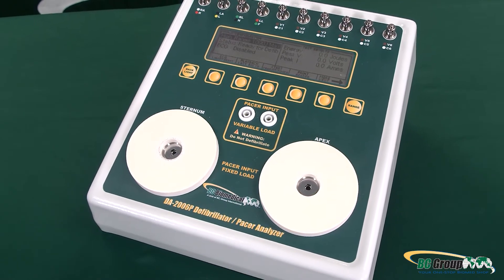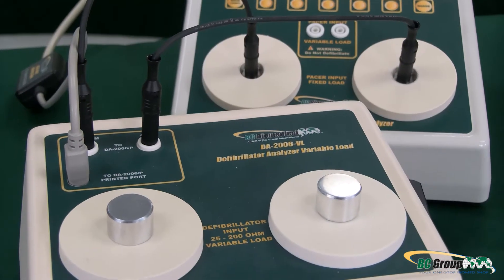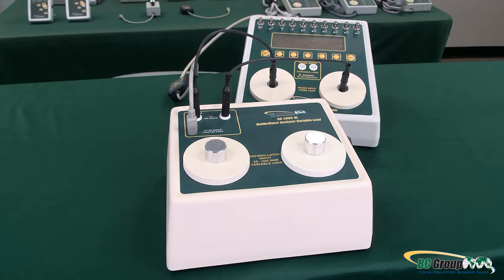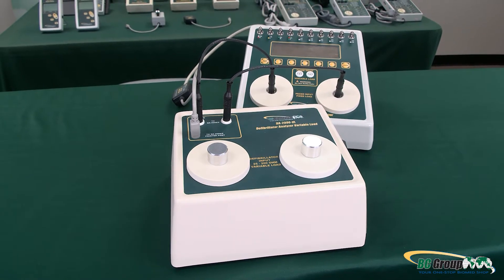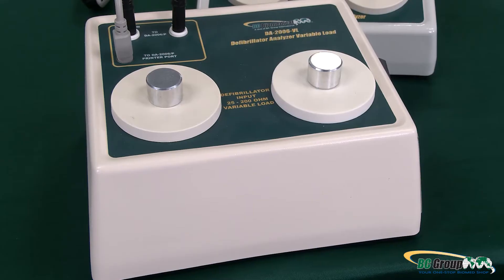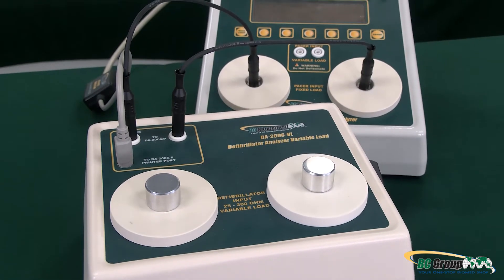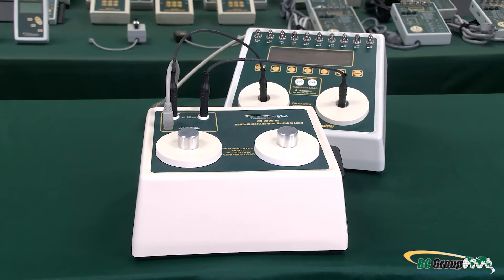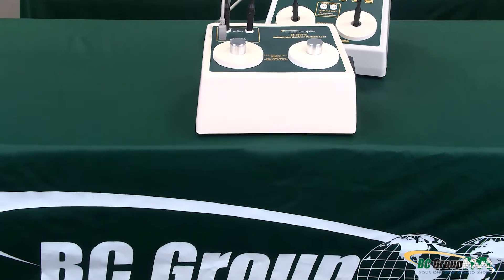The DA-2006 variable load module works easily with the DA-2006 series defibrillator analyzers and provides variable loads from 25 to 200 ohms in 25 ohm steps. When the DA-2006 VL is used with a defibrillator tester, it assures the proper electrical current is delivered to the heart — including all ranges from infant to large adult — per AAMI DF80 and IEC 60601-2-4 standards.